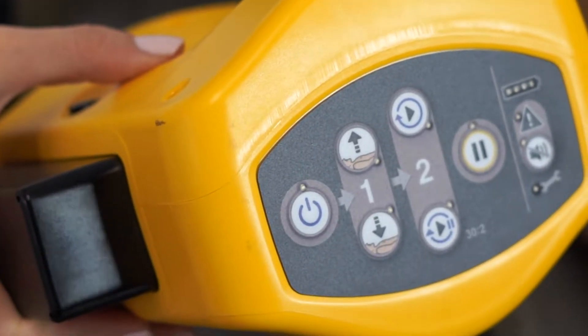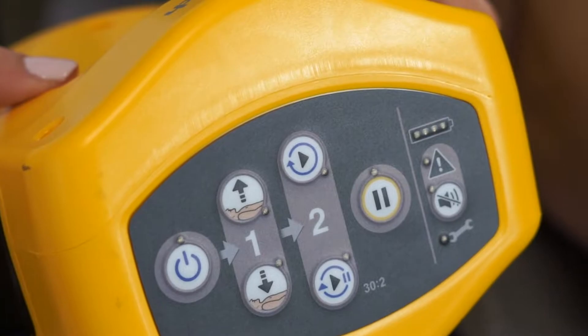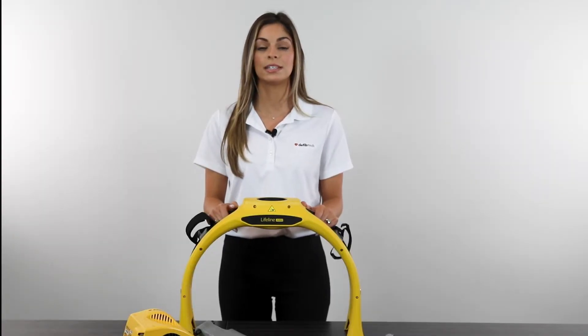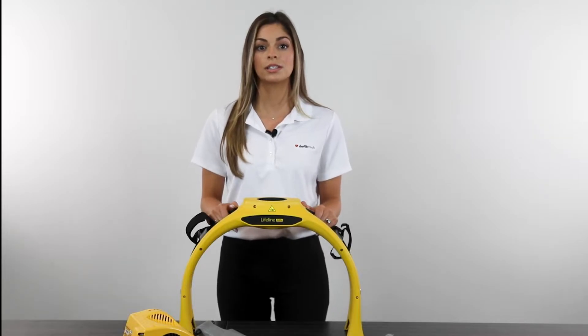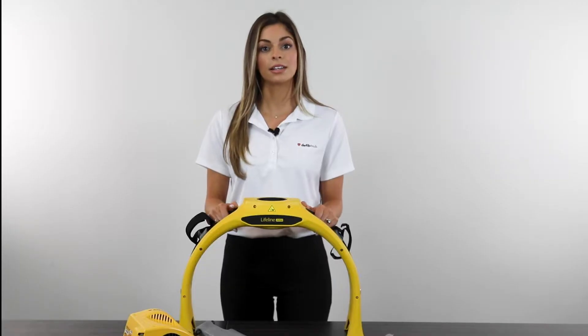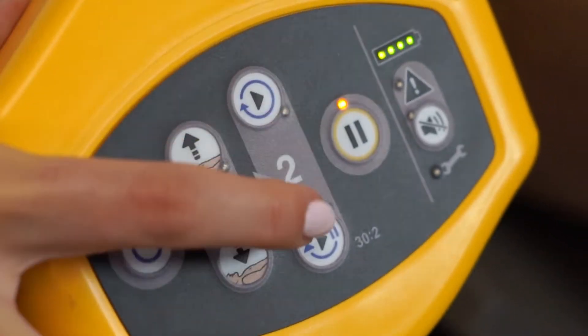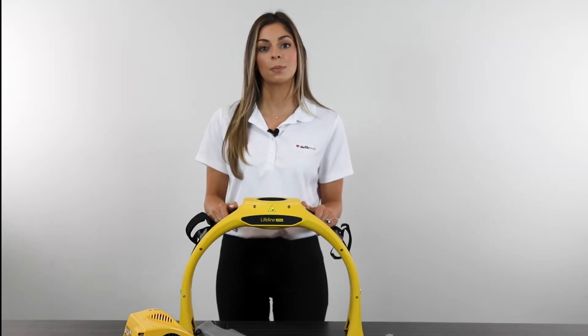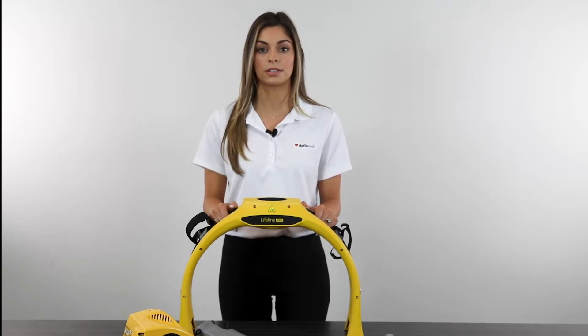The Arm has a streamlined user interface that makes mechanical chest compressions a breeze. Starting chest compressions is simple with two easy steps. First, adjust the compression height to the patient's chest using the up-down buttons. Next, start compressions by selecting breath or non-breath protocol. You can adjust your protocols in the middle of a rescue. At any time, press the pause button to halt and resume compressions.